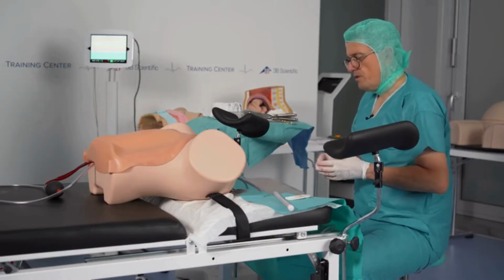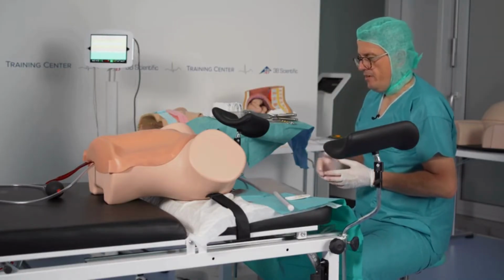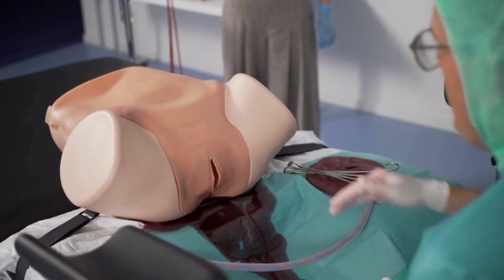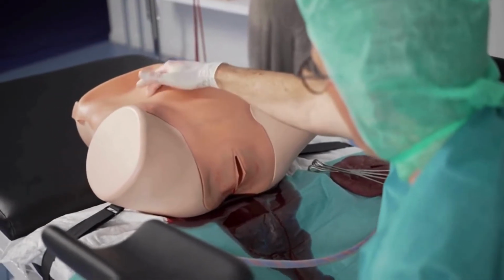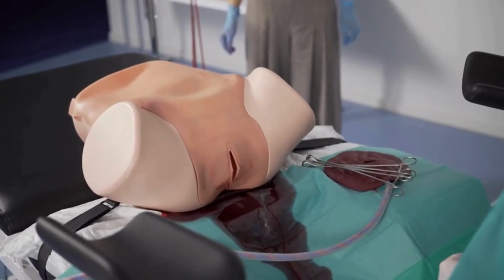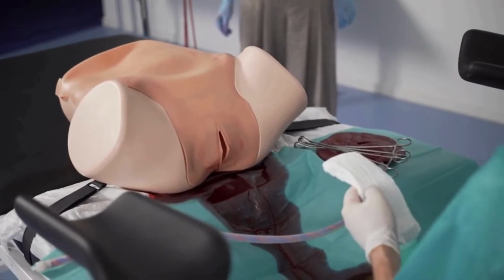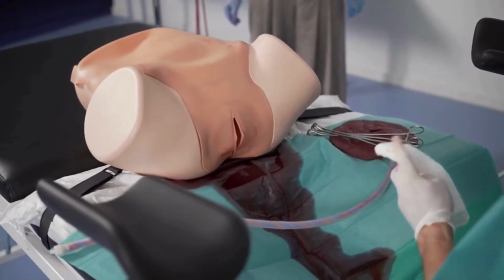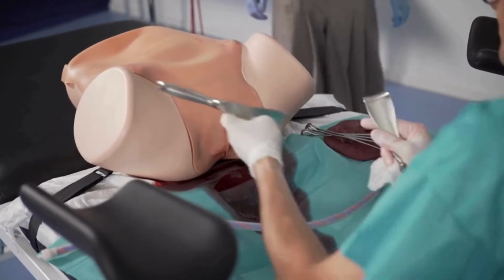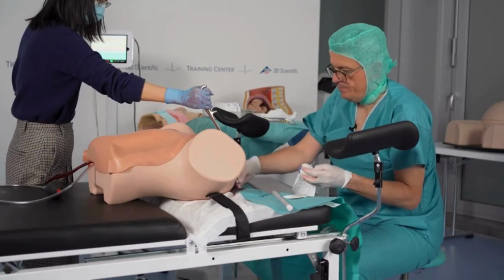So now we switch over to prostaglandins to get the uterus to contract better. And please stop the bleeding a little bit. But unfortunately, this doesn't help in this situation. So we decide to do another speculum and to do uterine packing. So please hold this. And I hold that.